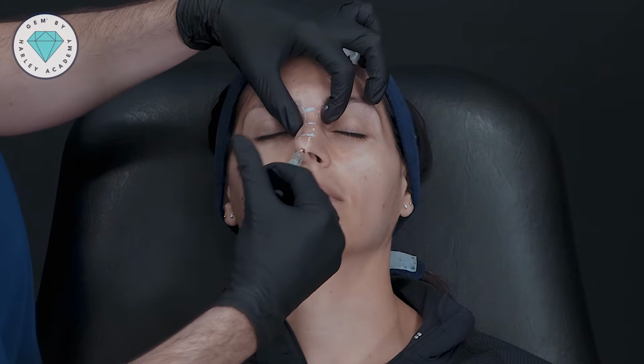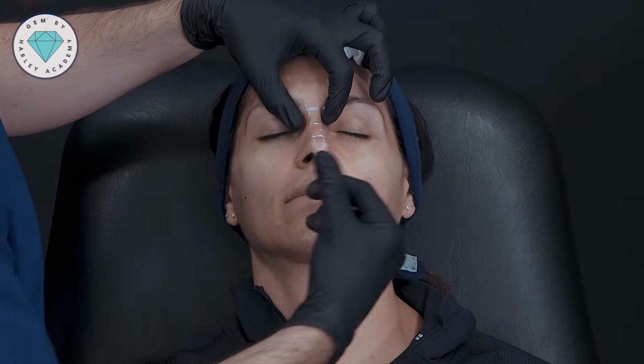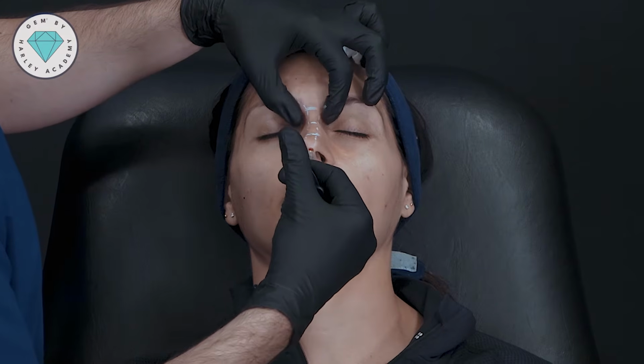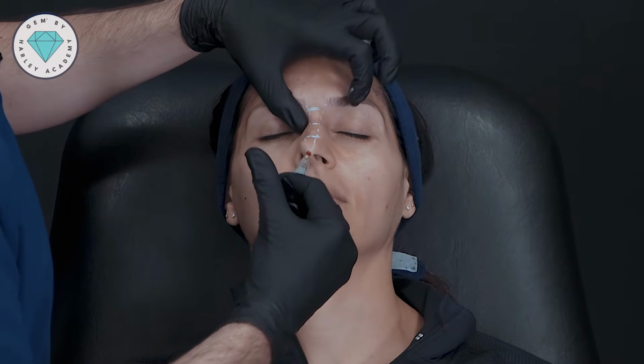Moving my cannula here just helps me feel like I'm safe or safer because I'm not adding a single bolus to any particular area of the nose.